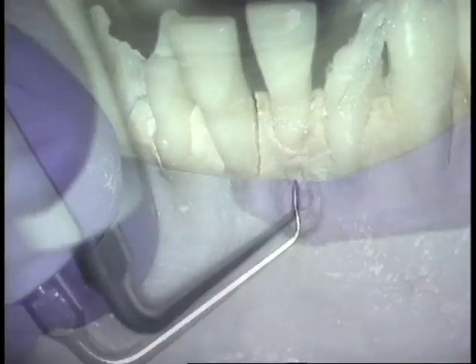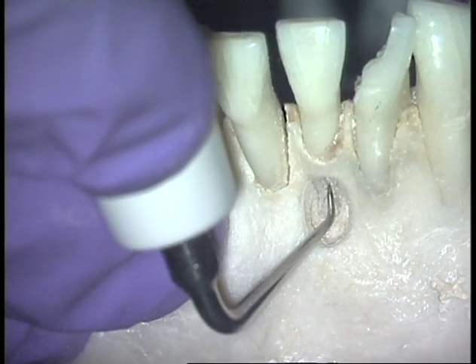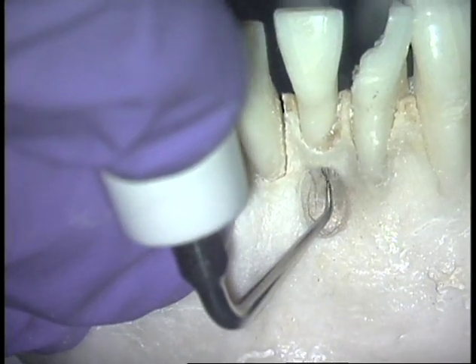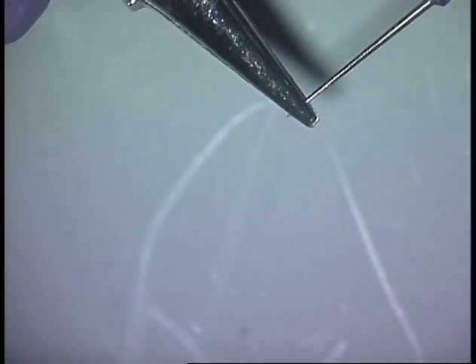Here's the CT4 tip cutting into bone. Having a selection of these tips on your surgical tray with orthodontic pliers allows you to create your ultrasonic tips custom during the procedure.